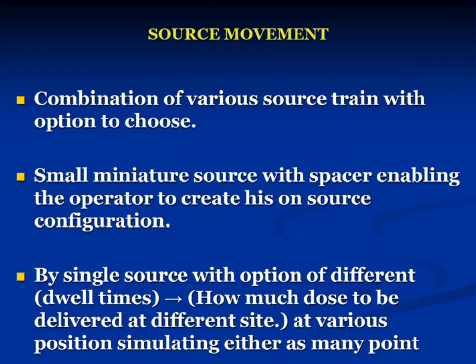The methods of application of brachytherapy are the preloading method, manual afterloading, and remote afterloading. Preloading is defined thus: in the earlier days, the sources were loaded in the applicator before they were inserted into the patient. That used to cause great harm from radiation exposure to the paramedical staff and the clinical radiation oncologist. Because of radiation exposure to medical and paramedical staff, afterloading methods were invented.